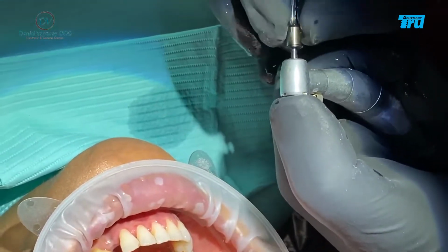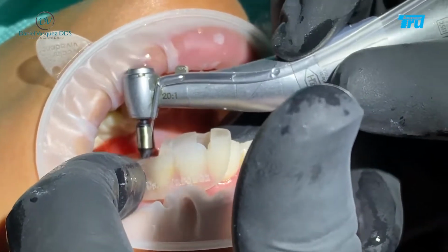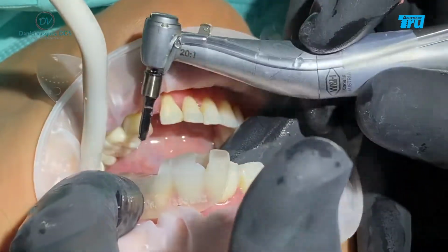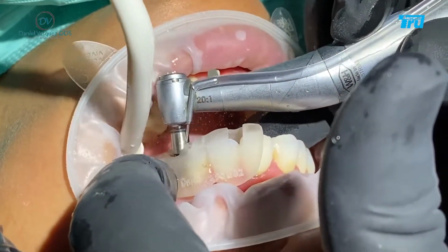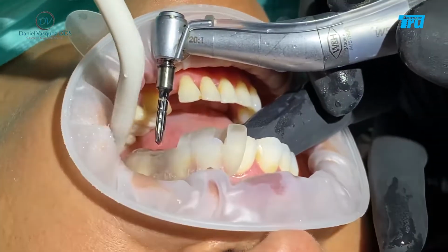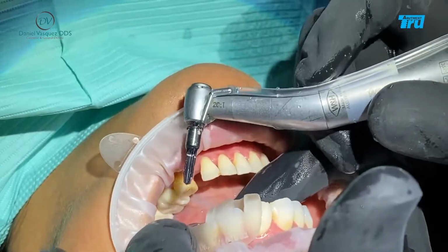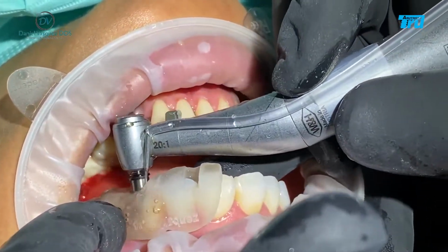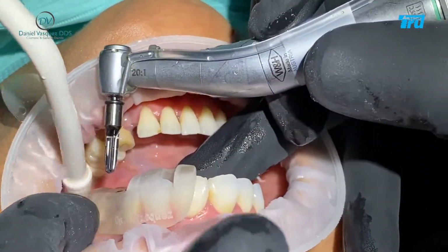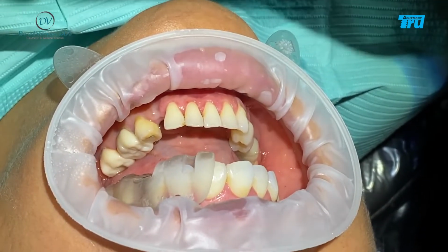So now we're moving into the 3.4, and this is 10. We are working our width. Beautiful. Excellent. Okay. We're just working some width. It's going perfect. And 3.9 by 11.3. This is our last drill.